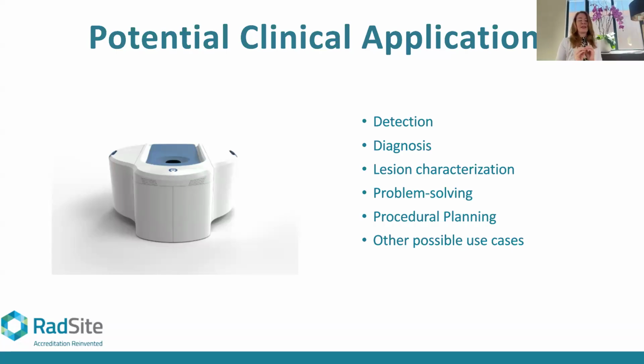So you're right, the resolution is incredible, and the information you can get about breast implants for cosmetic surgeons is really huge. And one other thing I'll add is that with traditional mammography in women with breast implants, we're very rarely able to see next to the implant, behind the implant. We just cannot evaluate that part of the breast. With breast CT, we're seeing all the way back to the chest wall. We're seeing ribs in most cases.